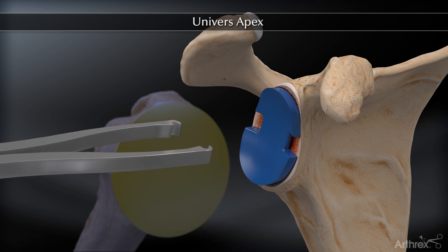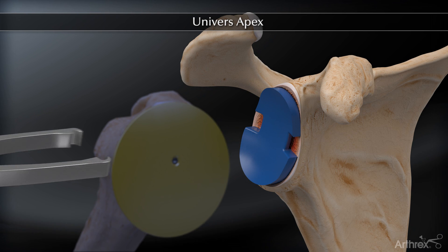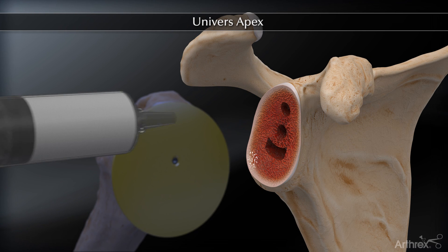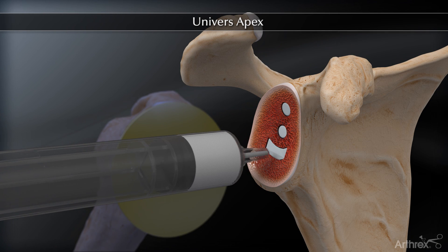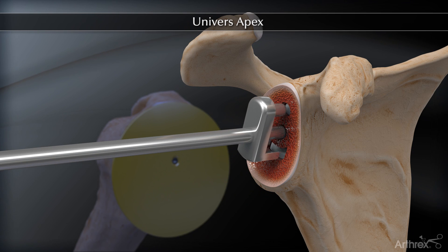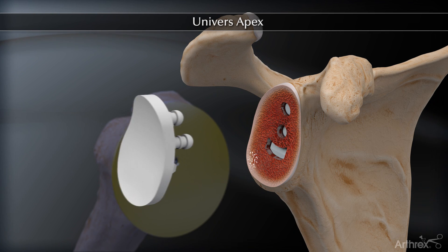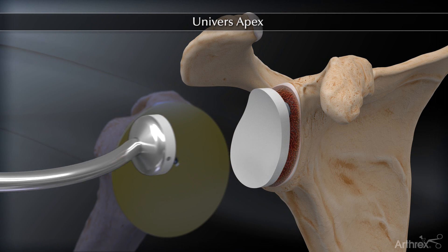Trial glenoid components are available to evaluate proper orientation and fit prior to cementing the polyethylene component. The glenoid vault is cleansed and dried, followed by cement injection. A pressurizing tool is available for displacing cement throughout the vault. The polyethylene component is then held in place while the cement hardens.